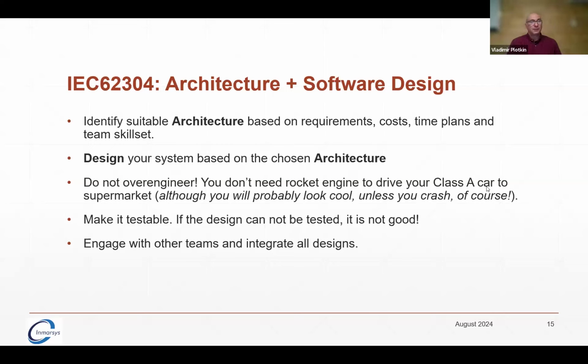And then once you're doing the architecture, you also need to involve different teams. For example, as I said, when you select a microcontroller, you need to be mindful of what the electronics team can put on the board. The same thing with mechanical engineers. So if you put a huge micro on the board, which really doesn't fit in a tiny blood glucose meter, then we've got an issue. So that's why you need to be in constant discussion with other teams.